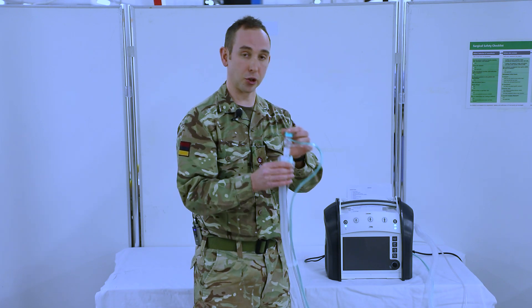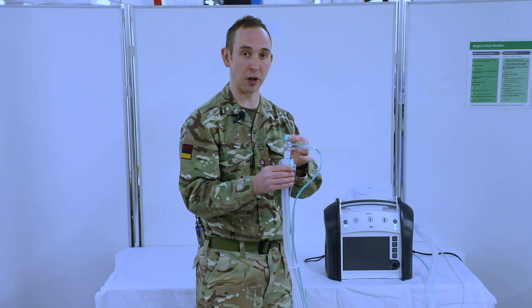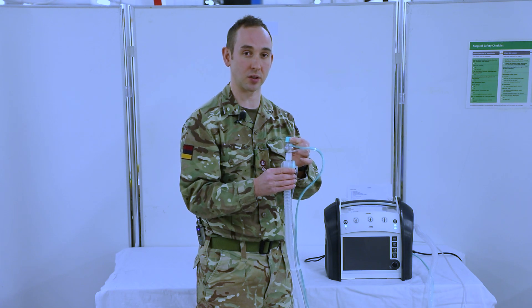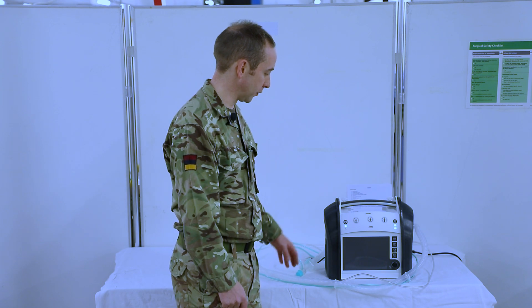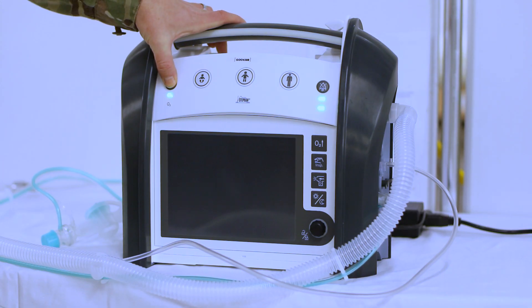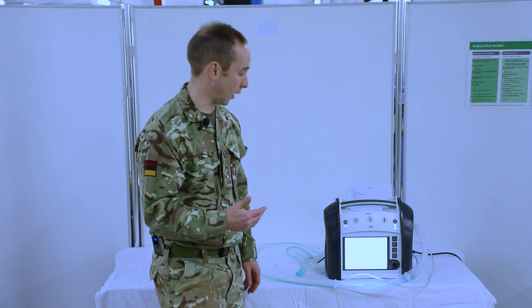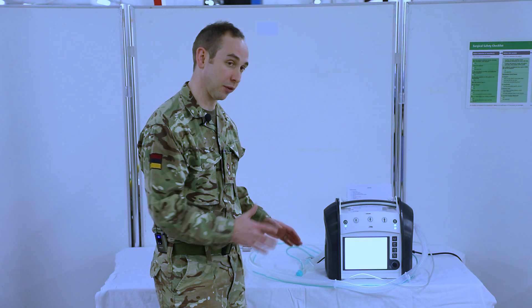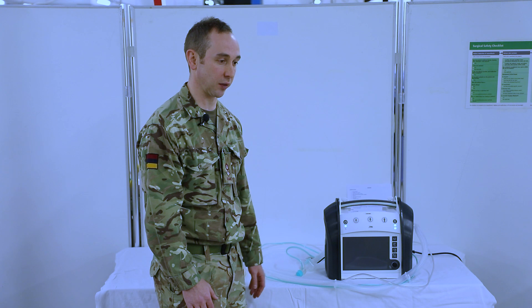The last part of this test is just to ensure that you have a cap over the end of the circuit itself to ensure it can pass its self-test. Once you've connected the circuit and have the cap on the end, turn the machine on, and at this stage it will run through its 70-second self-test. Just leave the machine to complete this and watch the screen to ensure it has completed successfully.